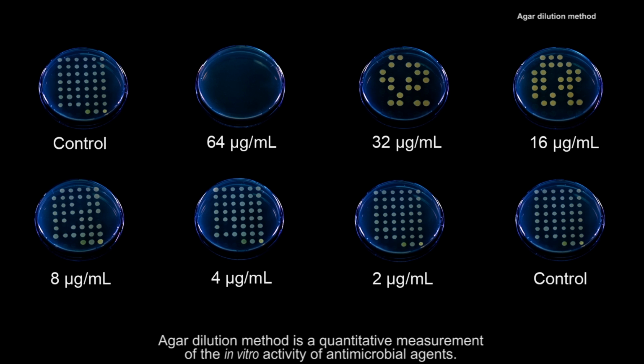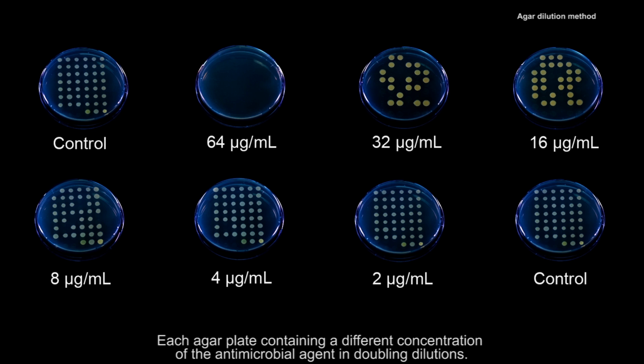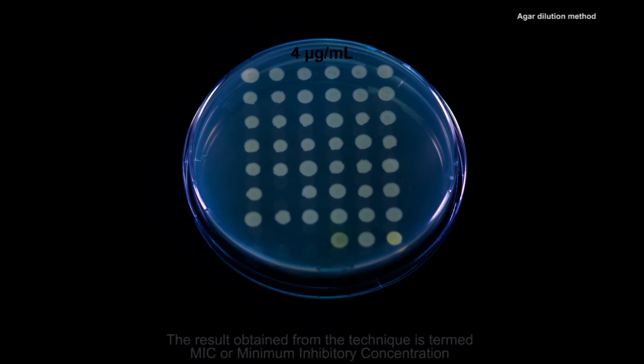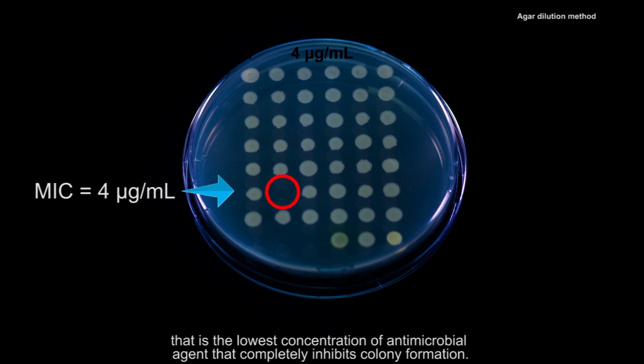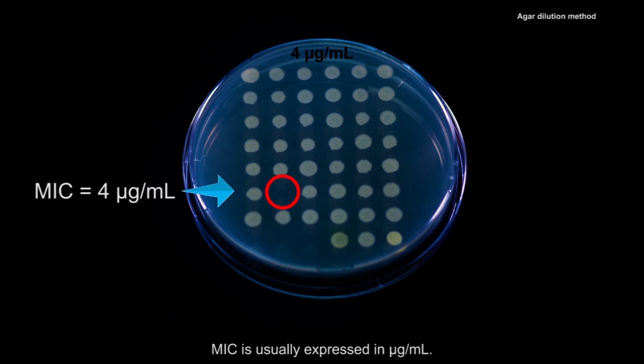Agar dilution method is a quantitative measurement of the in vitro activity of antimicrobial agents. Each agar plate contains a different concentration of the antimicrobial agent in doubling dilutions. The result obtained from the technique is termed MIC, or minimum inhibitory concentration. That is, the lowest concentration of antimicrobial agent that completely inhibits colony formation. MIC is usually expressed in micrograms per milliliter.